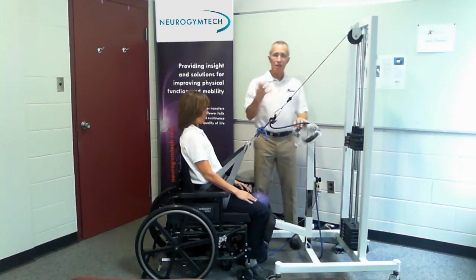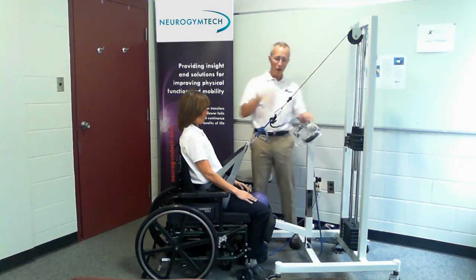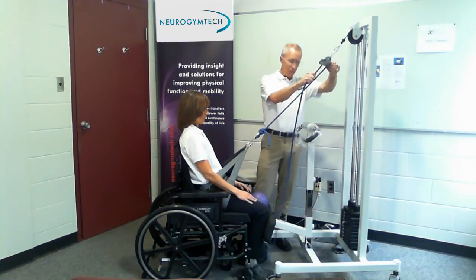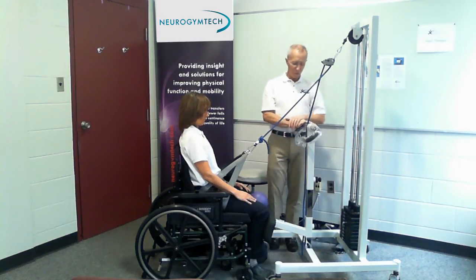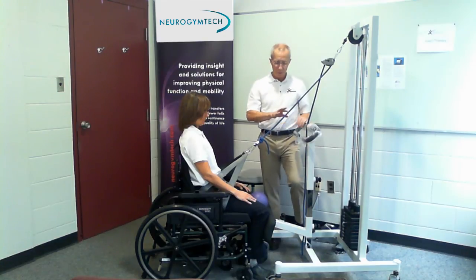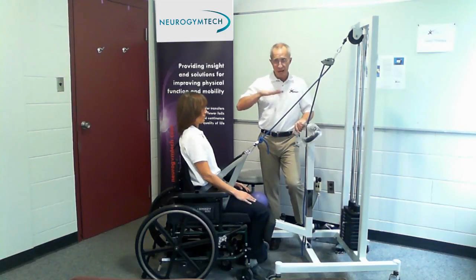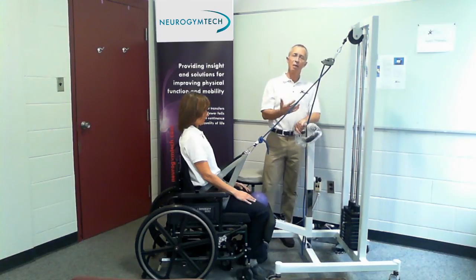That's basically how the machine works and a couple of issues associated with the generic patient. Now I'm going to walk you through four applications. The first is a large cognitively impaired individual who could be a mechanical lift. The second will be a hemiplegic patient. The third will be a person who has trouble landing the last 15 or 20 degrees. And the last one is teaching someone how to get up off the floor after a fall at home.